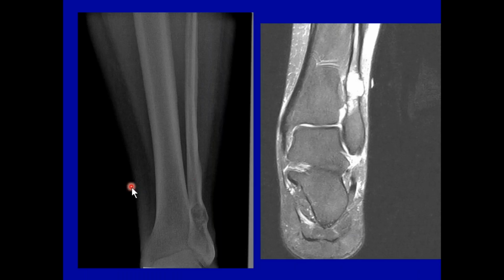One of the referring doctors that we work with took this ankle x-ray, but the first thing you're going to ask me is which side. I don't know which side. I do now because I ended up calling and saying, which side did you x-ray? Well, this is the left. I'm using it to illustrate the point that all x-rays should be marked with right and left markers, but in my world that doesn't always happen.